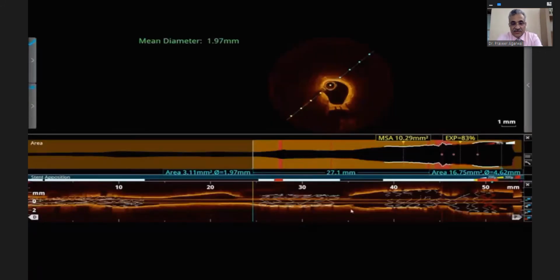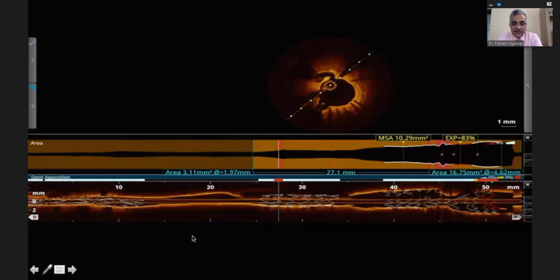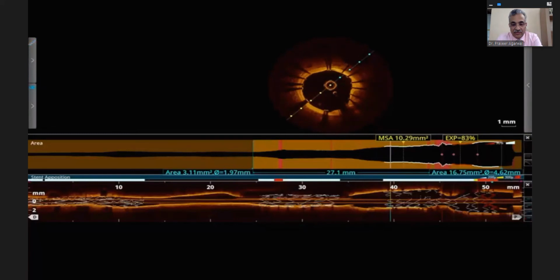Now see this image. The distal stent is doing reasonably well, well deployed, not much ingrowth. In the middle, you can see that section, but it's not really compromising. And now, this stent that we've used from distal left main to distal LAD, proximal LAD to left main.